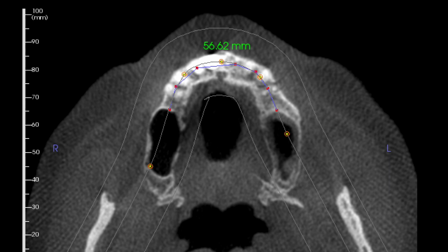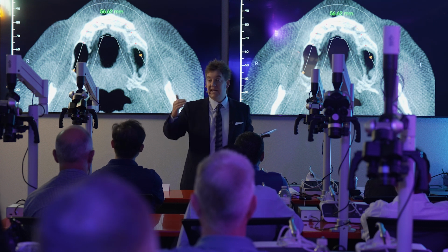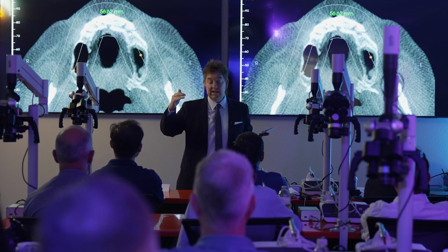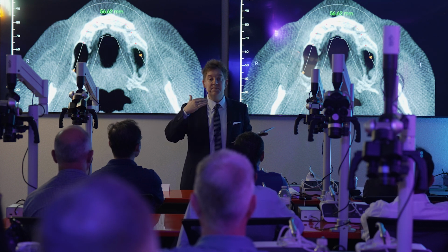Well, let's talk about Mark in general and his whole mouth. What do we have to be cautious of? Let's start in the maxilla because this is a good view to discuss it. So if all of his teeth are coming out, we want to keep the implants probably anterior to that unless we're going to do bilateral sinus lifts, which is always an option. And then we have his incisive canal, which may or may not come into play. Is there anything else we're necessarily concerned about? The nasal floor, maybe. Anything else? Not really.